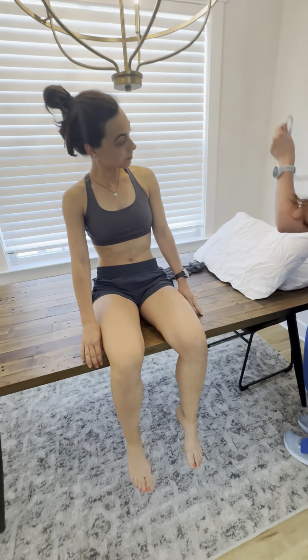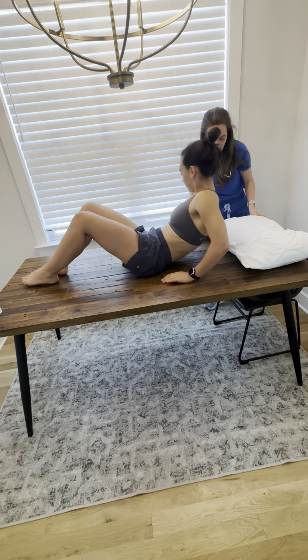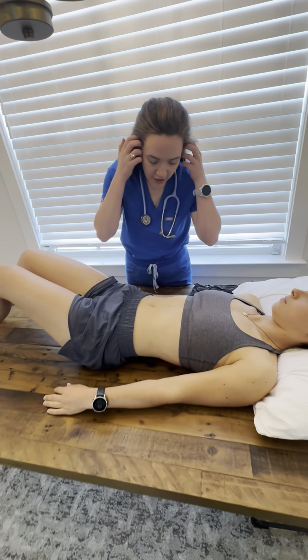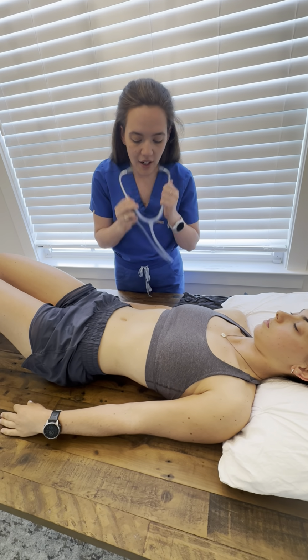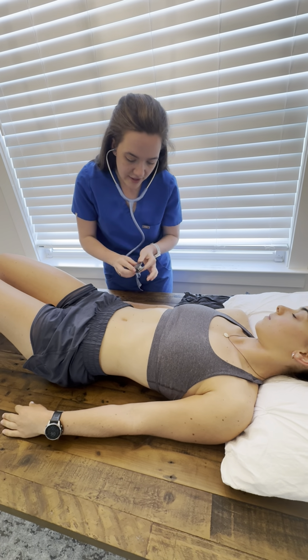Okay, we're gonna move on to the abdomen. So I'm gonna actually have you lay flat. We'll have your knees bent and your hands by your side. First, I'm just gonna inspect, symmetrical, not seeing any bruising or masses. And then we're just gonna listen for your renal and iliac arteries using the bell of the stethoscope.